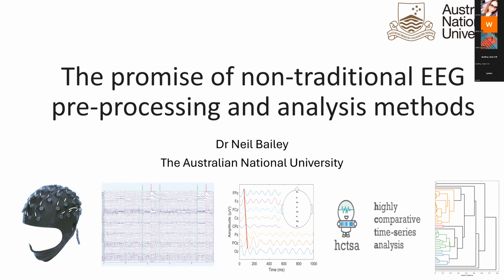One is that our results showed a similar pattern with the filtering to yours, where traditional wisdom seems to be that a high pass filter of 0.1 hertz is the best. And I think that's because previous research has shown that high pass filters can reduce the amplitude of, for example, the P3 event-related potential.